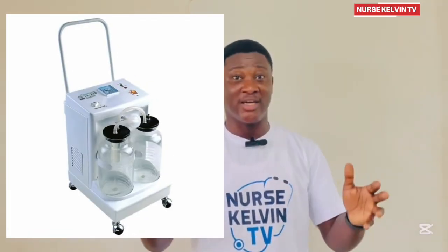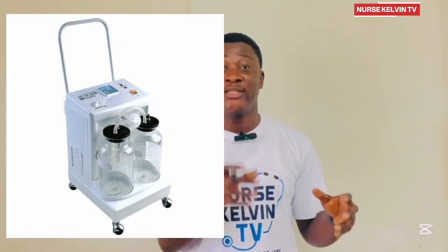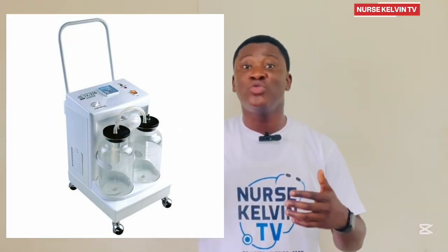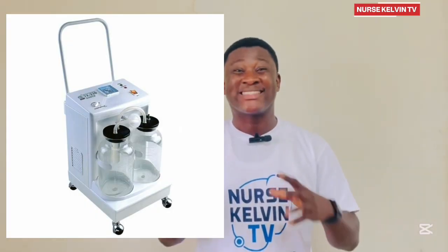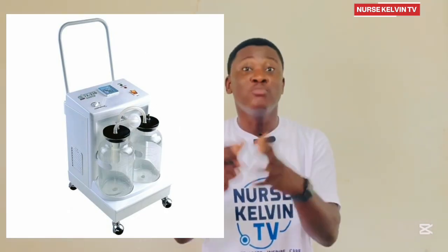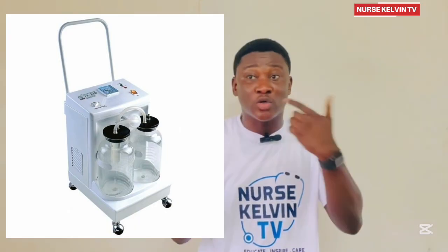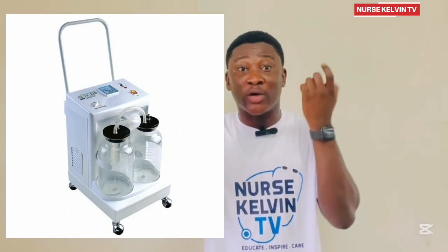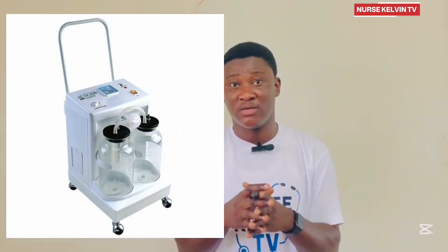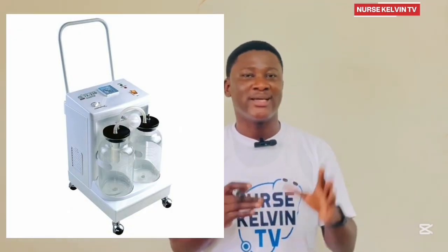Then the next one is the suction machine. This is a device that's used to remove secretions, blood, and mucus from the lungs or other places where there is a blockage in the airway. That's the use of the suction machine.